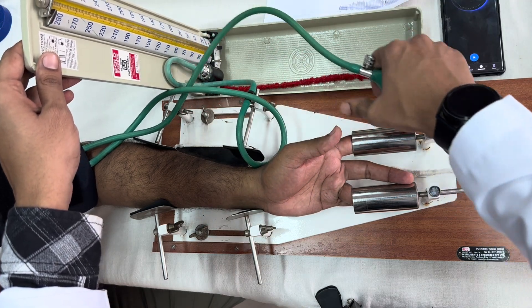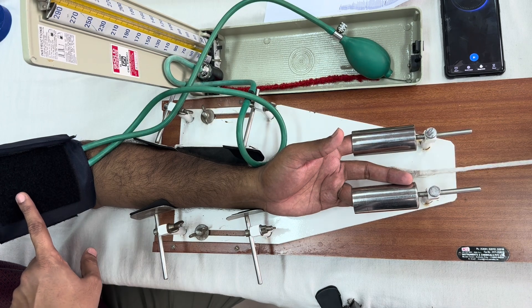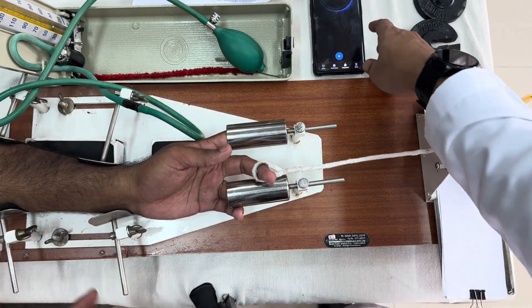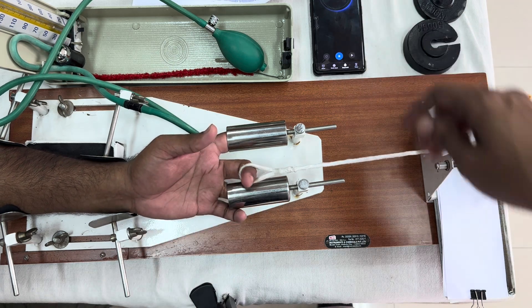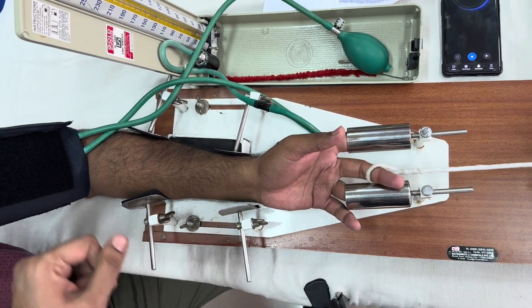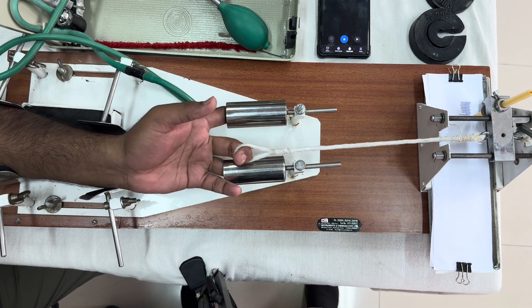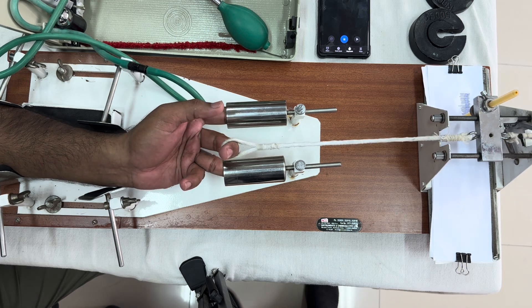Tie the knob and raise the pressure. You can keep it at 40 to 50 millimeters of mercury. Now the pressure is at 40 mm Hg. The person will now perform the same procedure with venous occlusion applied. Same instructions are given. Now start. The person is performing the same exercise. The only difference is we are occluding the brachial veins with 40 mm Hg pressure. They should not stop in between. Whatever contractions are recorded when the muscles get fatigued, we take that. This demonstrates the effect of venous occlusion on the phenomenon of fatigue. We also record the duration.